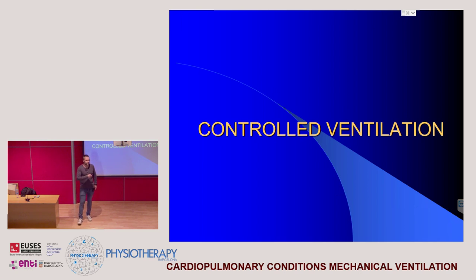In terms of ventilation, it means that in the first step, the ventilator has to perform all the work, and the patient usually is completely sedated, so doesn't do anything. During the treatment or the evolution of the principal disease, the work of the ventilator decreases and the work performed by the patient increases.